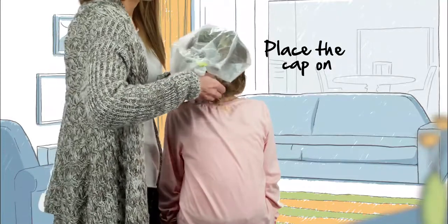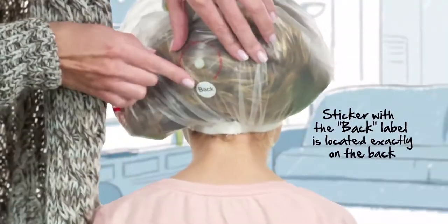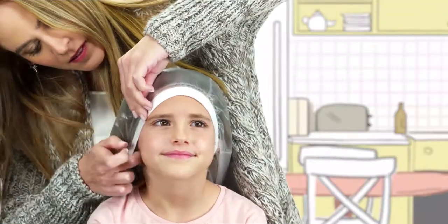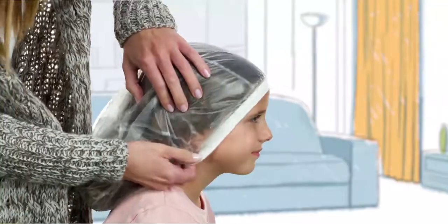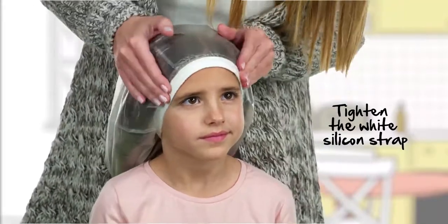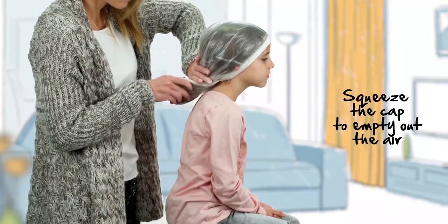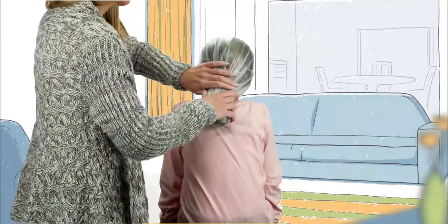Place the cap on the child's head so that the sticker with the back label is on the back. Make sure that the hair and ears are fully covered by the cap. Tighten the white silicone strap at the front of the cap to the forehead, then gently squeeze the cap to empty out the air. It is essential for the success of the treatment.